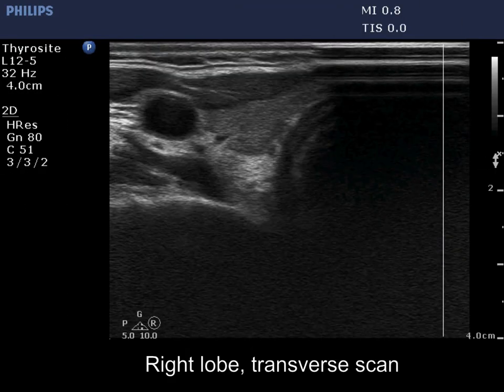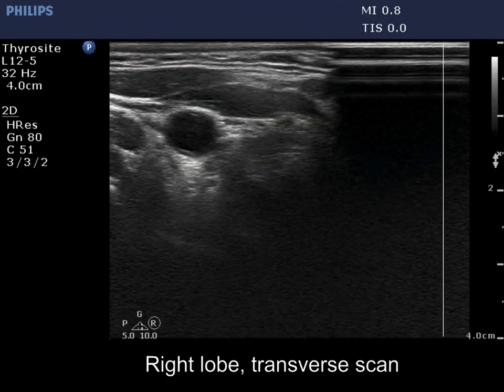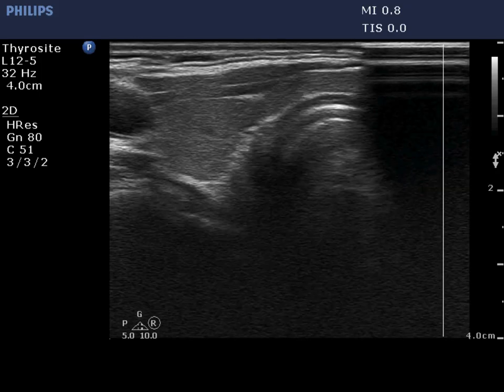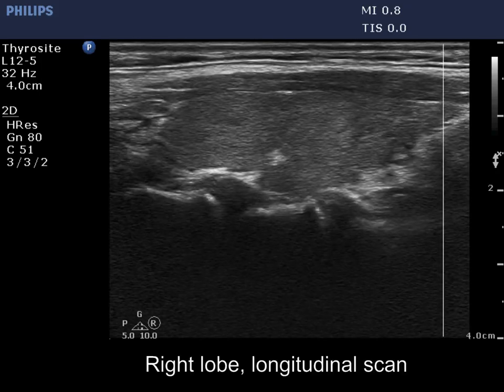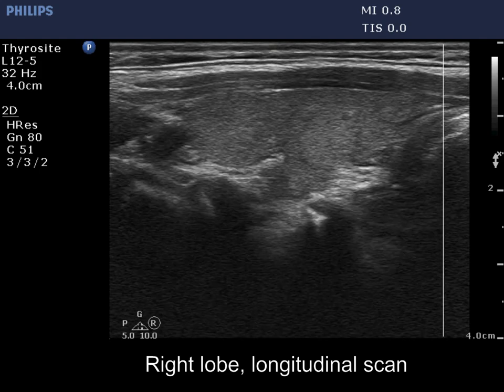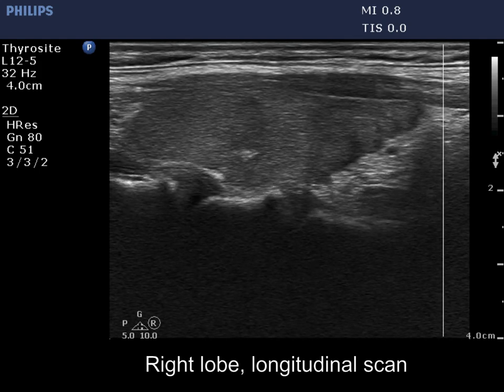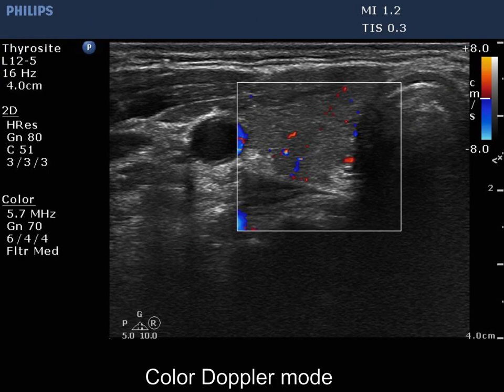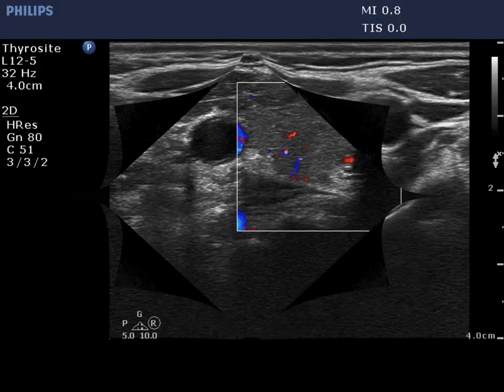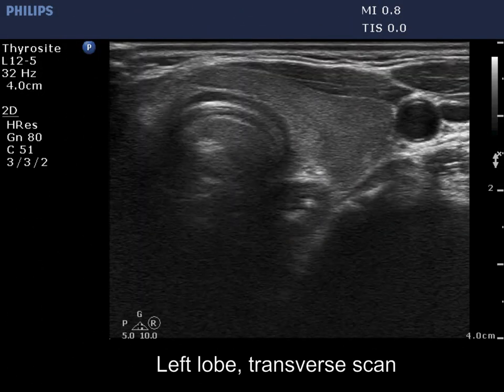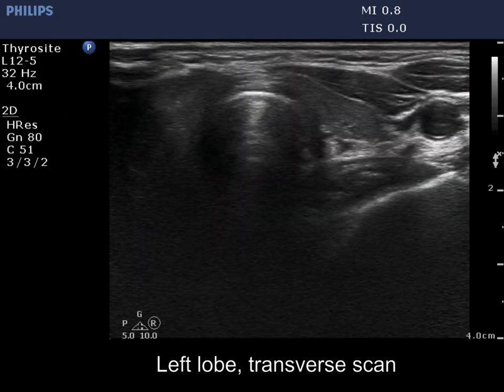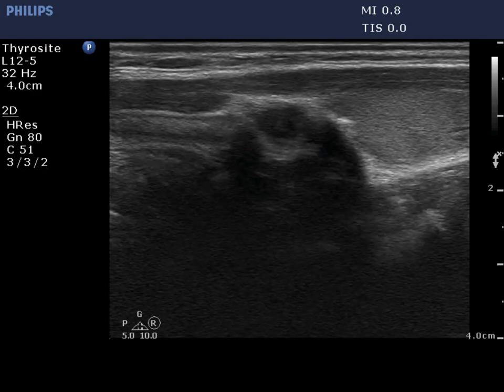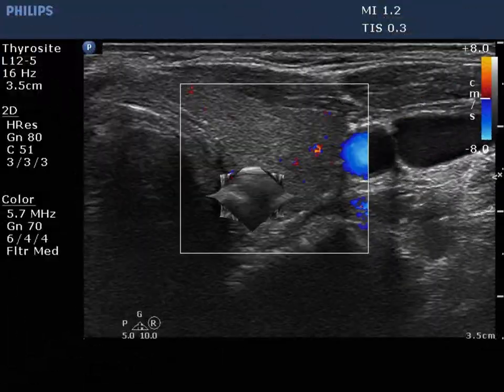The thyroid is minimally hypoechoic or echonormal. Compared with the previous examinations, the proportion of hypoechoic areas decreased substantially. The left lobe has a similar presentation. This pattern now corresponds to an intact healthy thyroid.